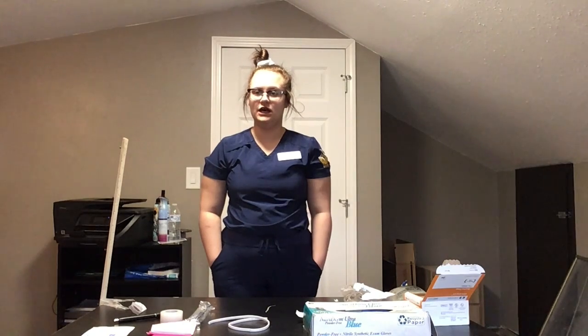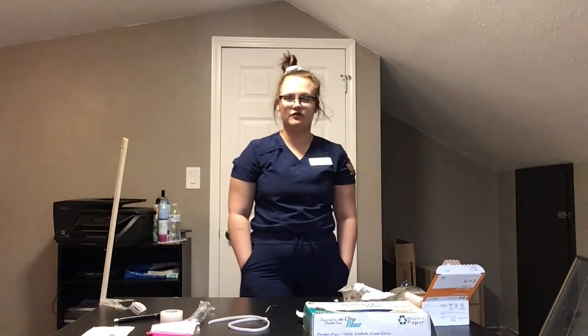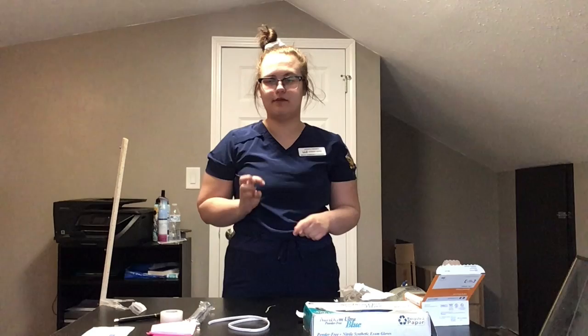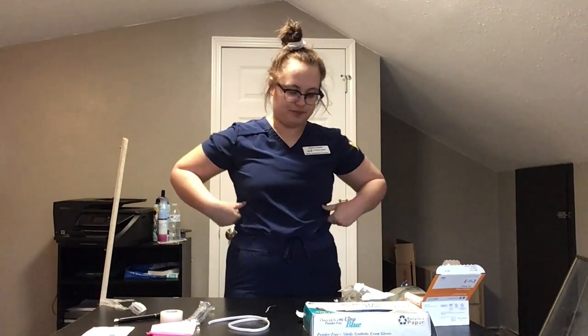My name's Corinne Freeman, and I'm going to be doing the IV skill today, starting an IV infusion and then monitoring the infusion. First, I would make sure to prepare and administer all medications according to the 6 rights of patient and medication administration, which are right route, right time, right dose, right medication, right patient, and right documentation.